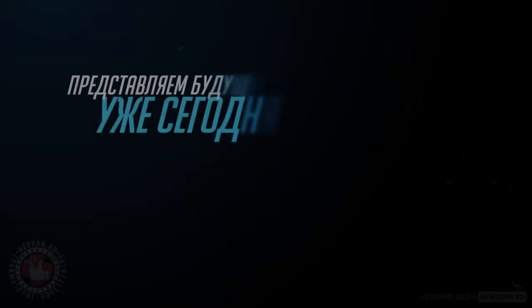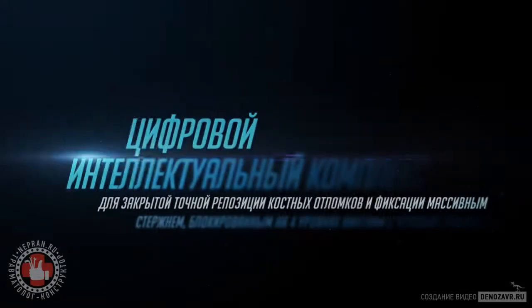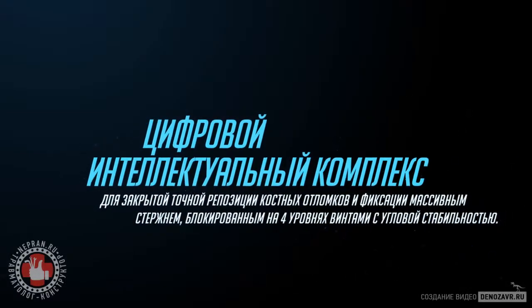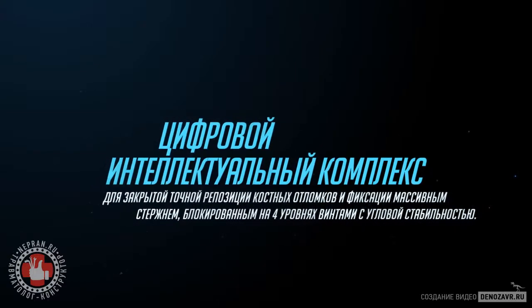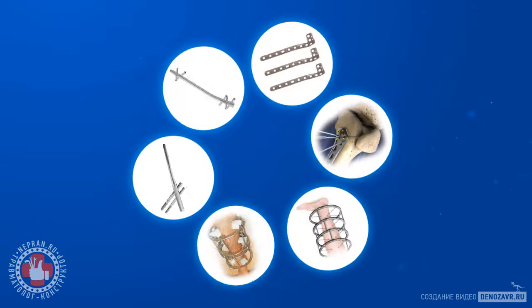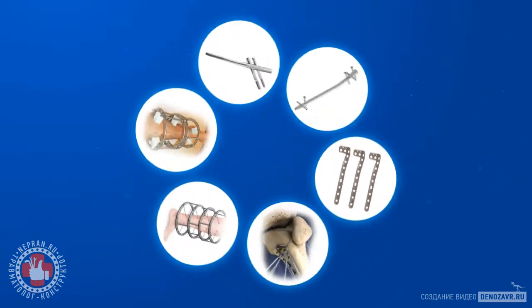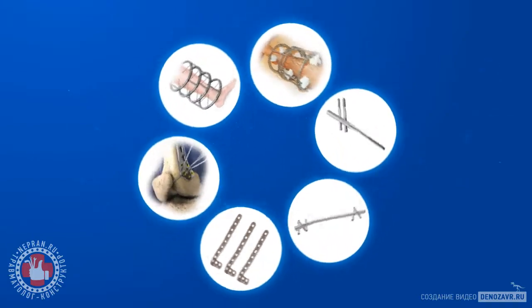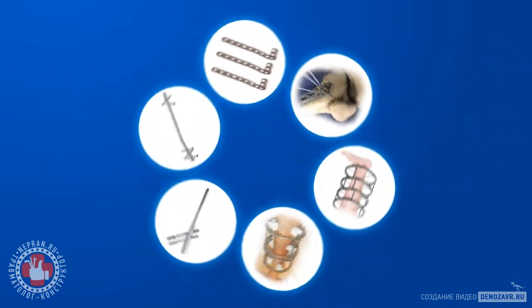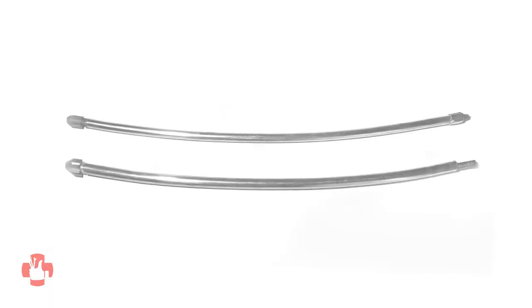A digital intellectual system for close, accurate reposition of bone fragments and their fixation using a massive rod, locked at 4 levels with angular stability screws. Here are shown methods which once made a breakthrough in fracture management, mostly due to the increase in strength of the fixation of fragments, and then a long stagnation. We have combined the best qualities of these methods into one whole.